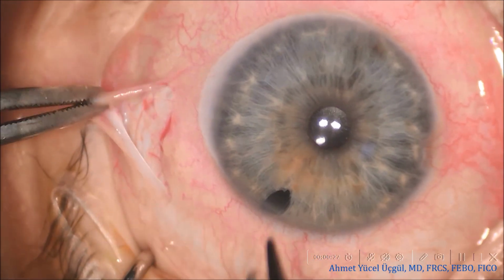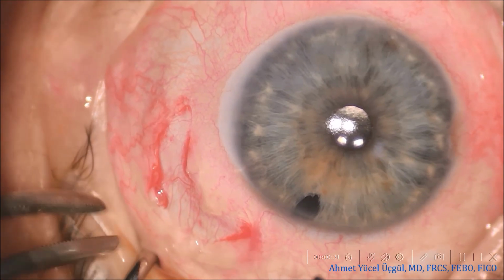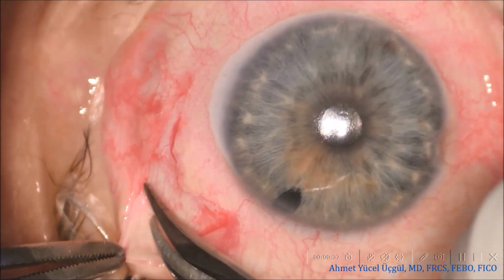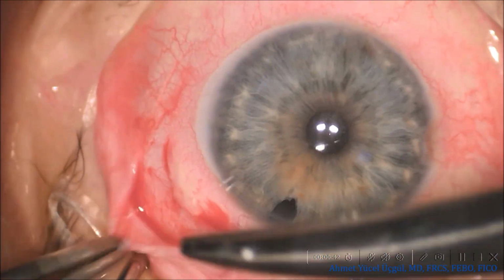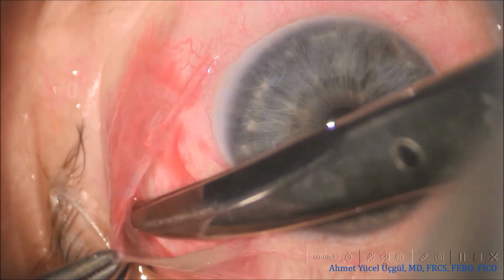During creation of the pocket for the plate in the superotemporal quadrant, it is important to switch from Westcott scissors to Stevens scissors. Because of the larger profile of the Paul Glaucoma implant plate, Stevens scissors allow a broader and more suitable posterior pocket to be fashioned, ensuring that the implant sits comfortably and without undue tissue tension.